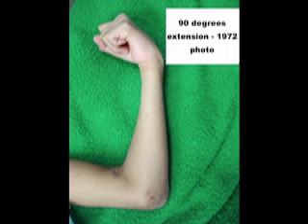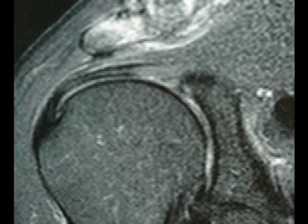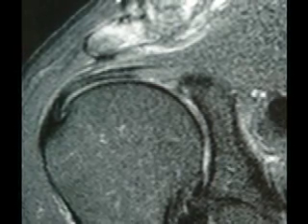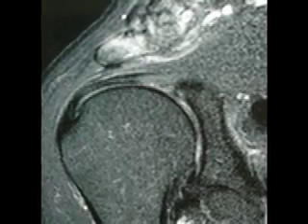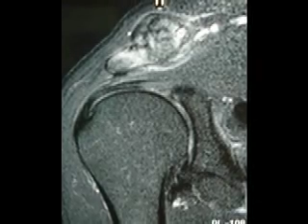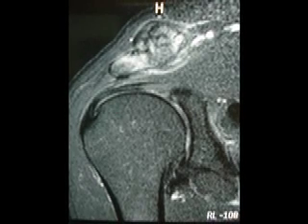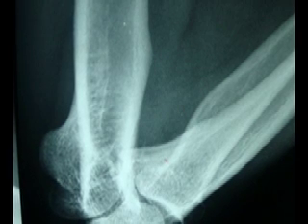This patient came to me 1 year ago with advanced degenerative AC joint disease in his right shoulder, and in January 2010 we performed an arthroscopic Mumford and arthroscopic distal clavicle resection in his right shoulder, and he had a very fast and good recovery. And then I told him that we could investigate his left elbow stiffness and that perhaps we could release it arthroscopically. Initially, we asked for some x-rays.